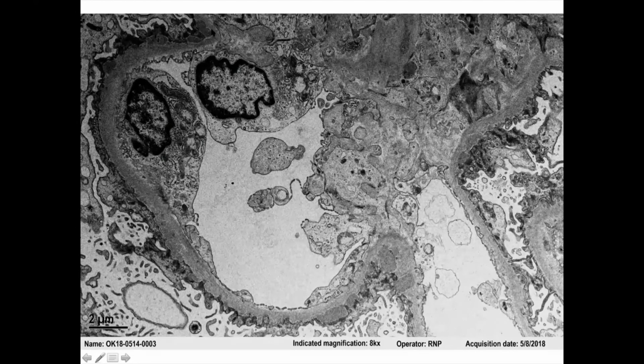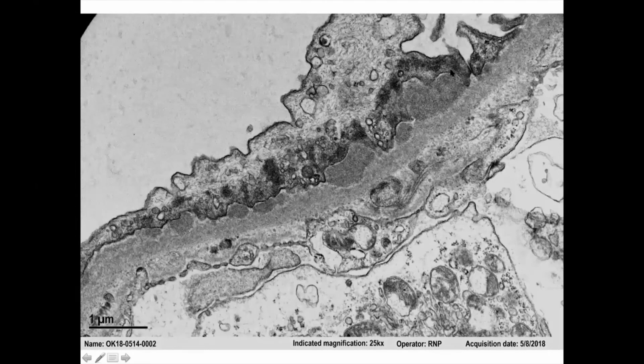So where do we have deposits? We have them here along our podocytes, and we have subepithelial deposits. Here as well, can you see this? All of these we have them. These are subepithelial deposits. Again, we have subepithelial deposits.